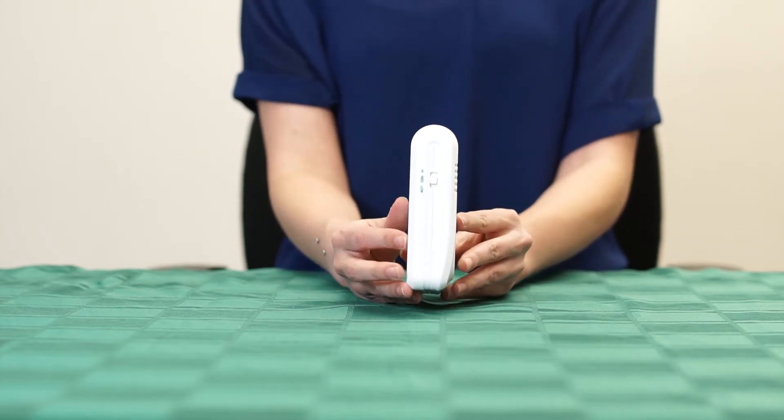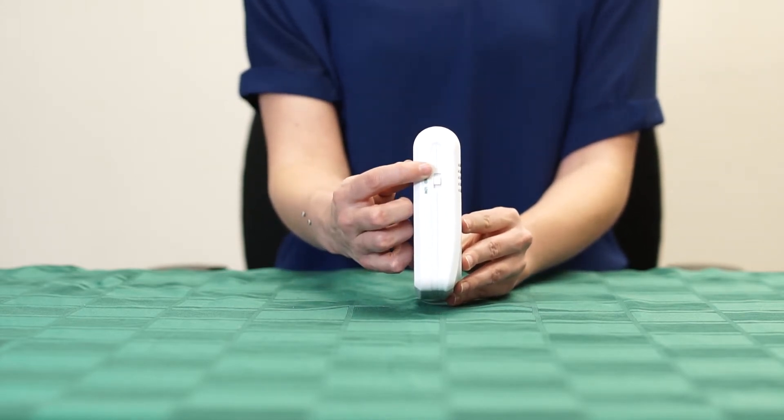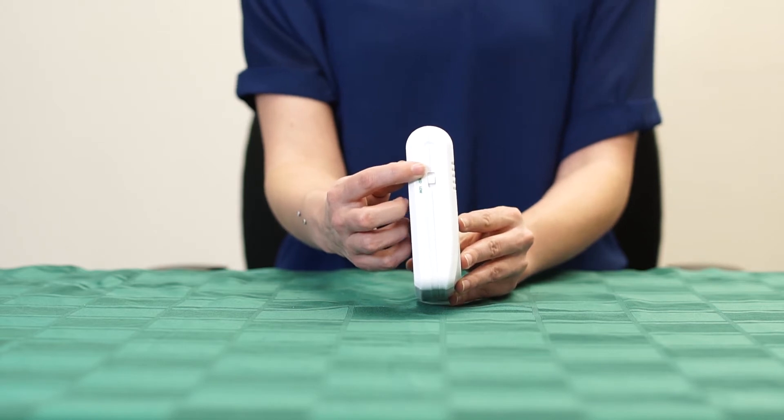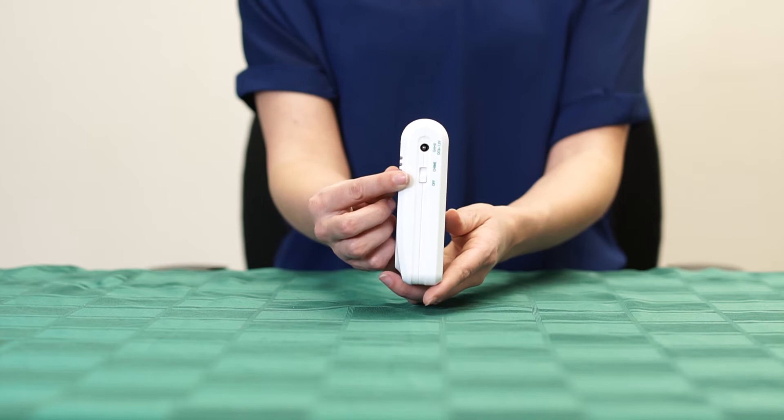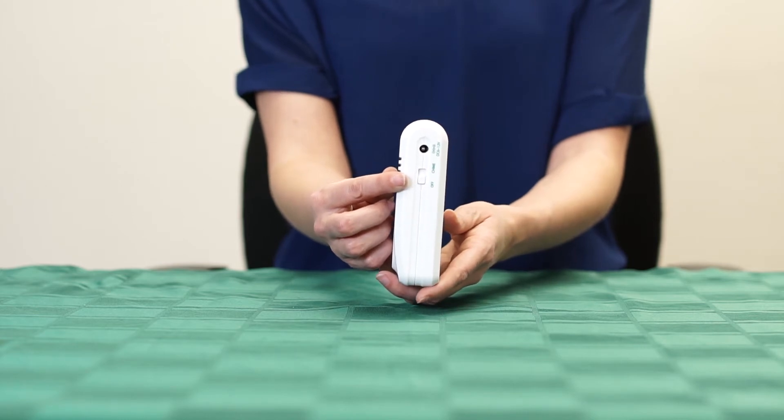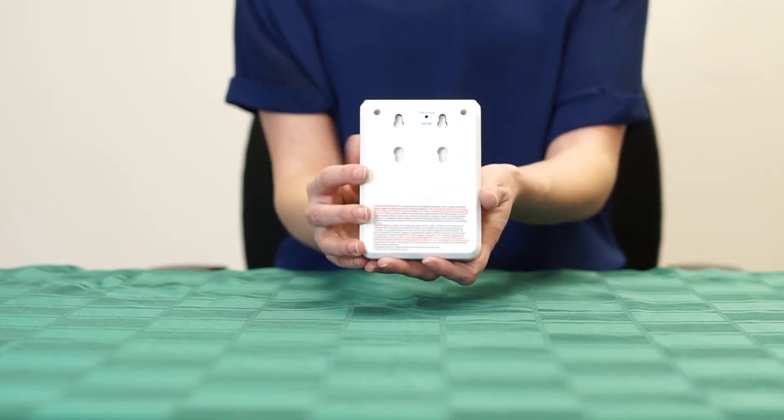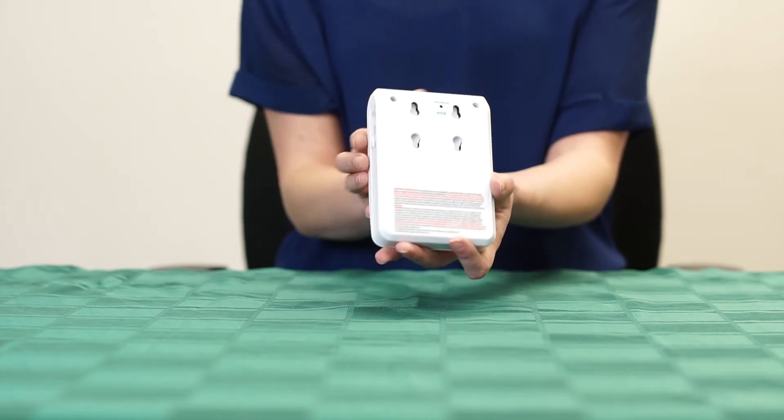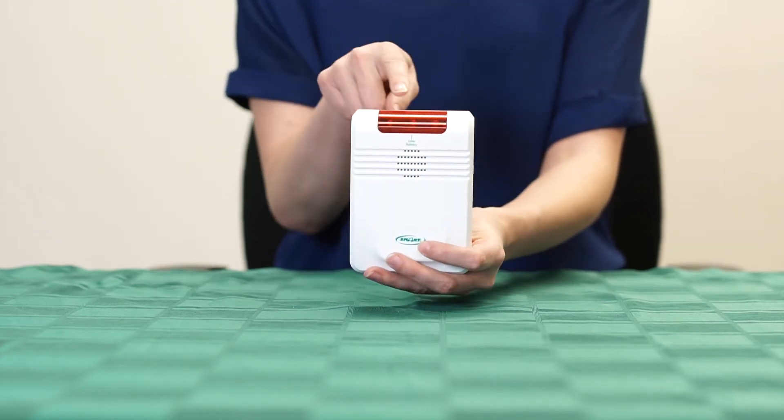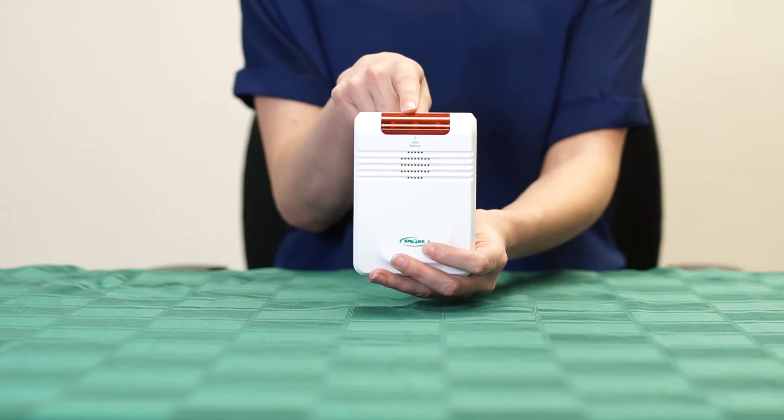The 433EC economy cordless monitor features a low, medium, and high volume control, an off and chime switch, a program button, and a low battery LED indicator.